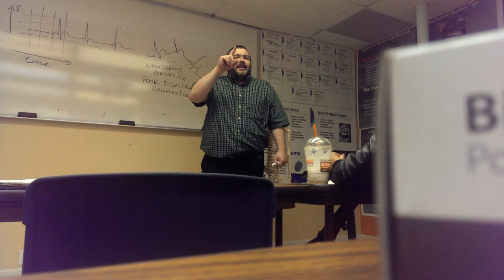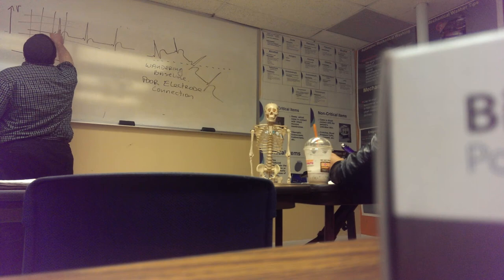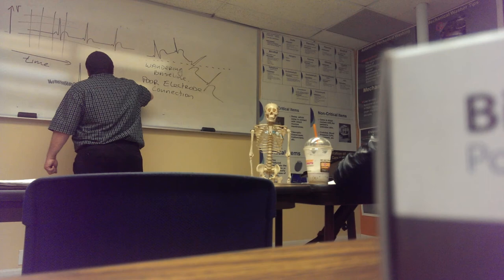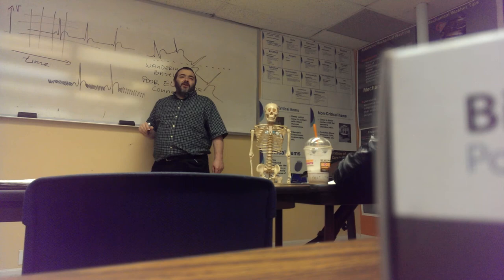And then there's one more problem that you can fix. And I'm going to show you what that looks like. Do you see how flat and neat my lines are? But sometimes you will see your EKG like this. Or some variation of this.